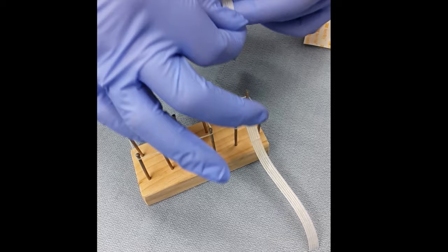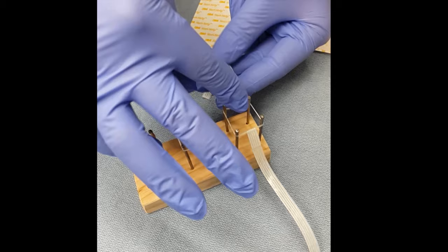Parents are taught how to make the tapes so they can do it themselves at home. This is an example of two retention tapes and the longer base tape which would be used for an infant with a complete unilateral cleft.